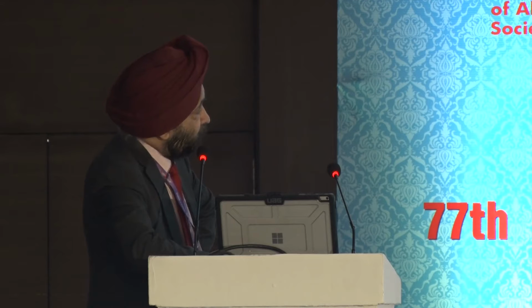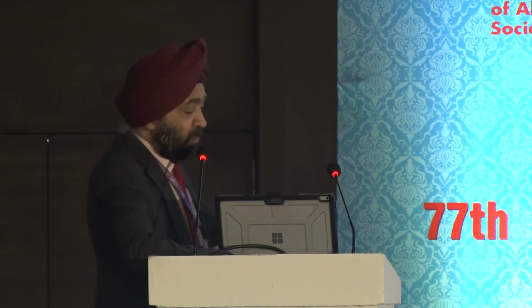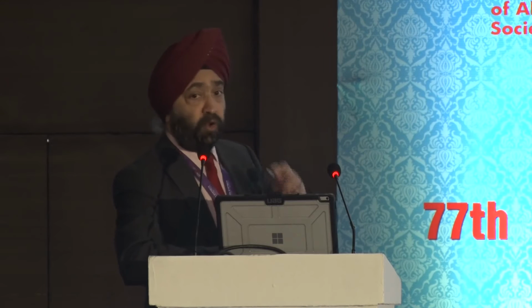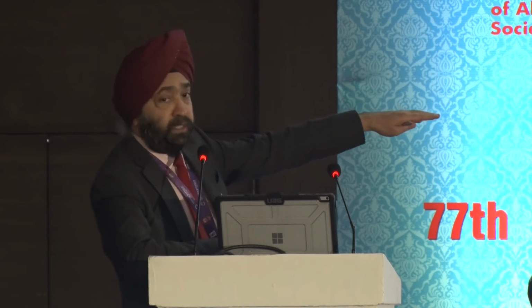And just to show you that now you can work and go ahead. And this is my final thing, which is a corneal opacity. Once there is corneal opacity, how would you do a phacoemulsification in such a patient? So the principle is to shut off the microscope light and to use what is known as chandelier illuminator. So this is a self-retaining chandelier illuminator which every VR surgeon has.